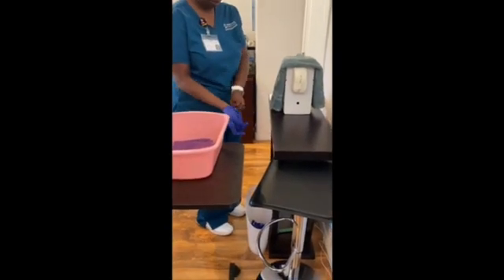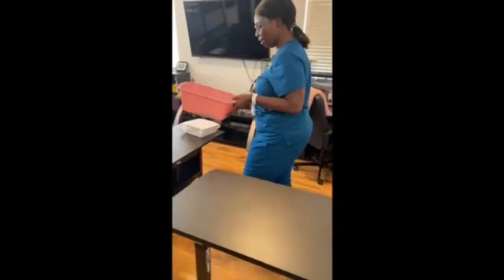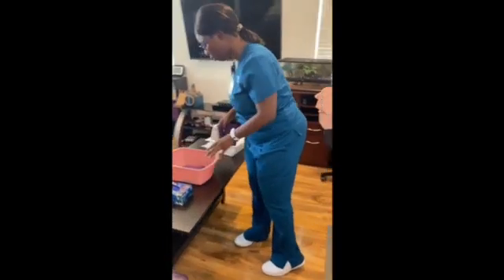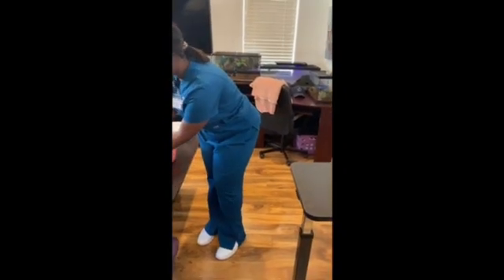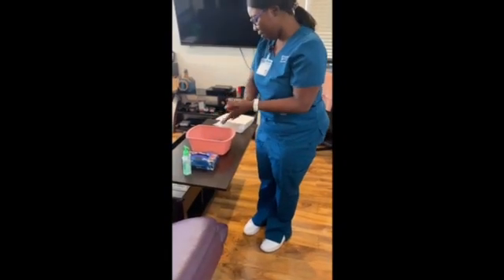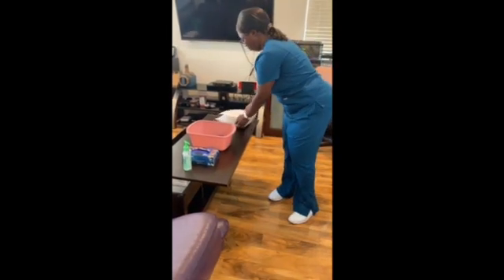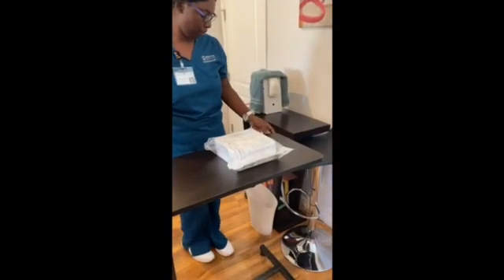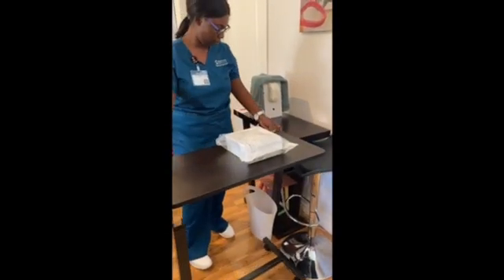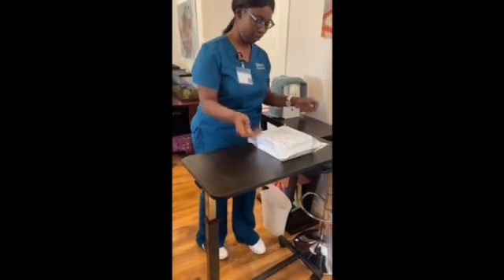I am now doffing gloves. So now I will empty out this water and put new hot water in to get ready for later use, which will be after we're done, to do peri care after the Foley. Hot water is used because during the time that the water is sitting, it will start to cool down. I now place the bedside table within reach and the trash can on the floor near the bedside.